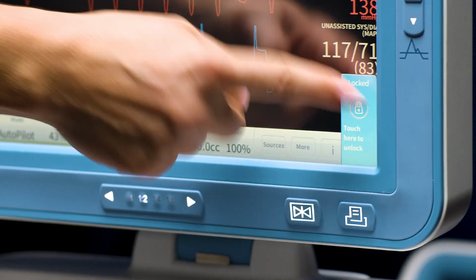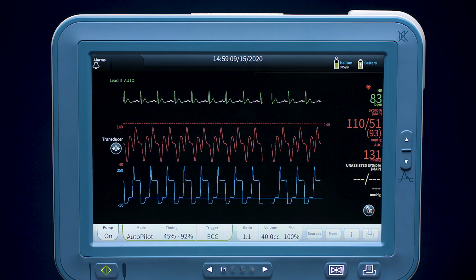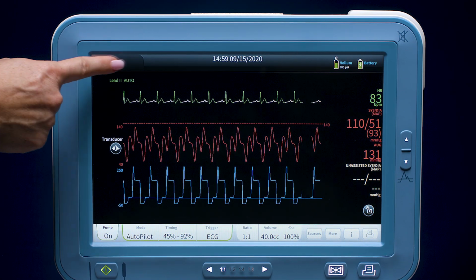The unlocked icon displays. There are several icons located on the display screen. The bell icon indicates that the alarms are on. Information regarding alarm system status, alarm values for MAP or AUG, and the alarm history will be displayed in the Alarm tab. To access this information, press the Alarm tab or the bell icon.